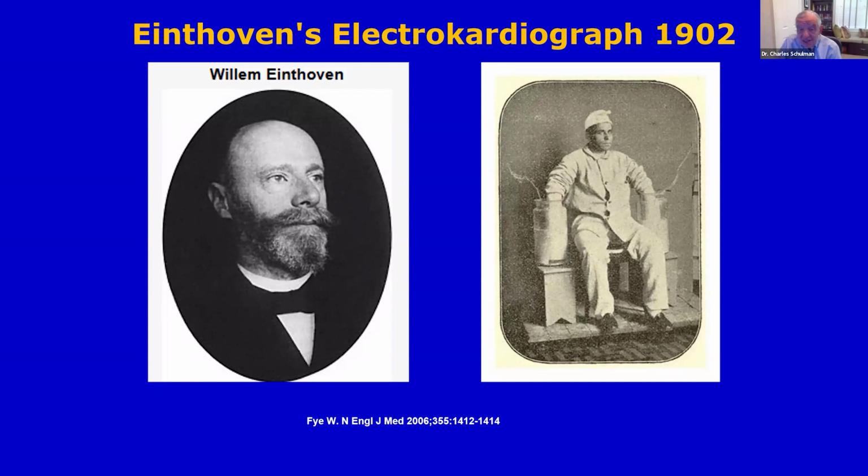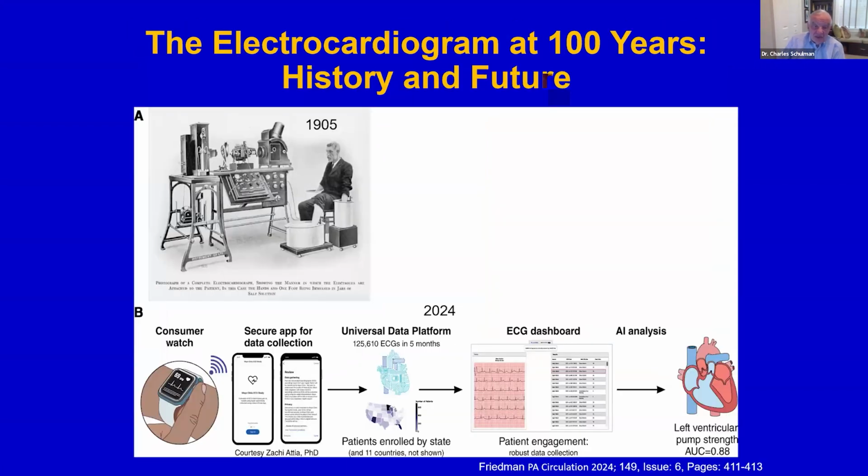You notice that he has his hands in 2 buckets of saline and doesn't look very happy. We've come a long way, as you can see. Here's another one of the early EKG machines. And this fellow also has his hands and 1 foot in buckets of saline.